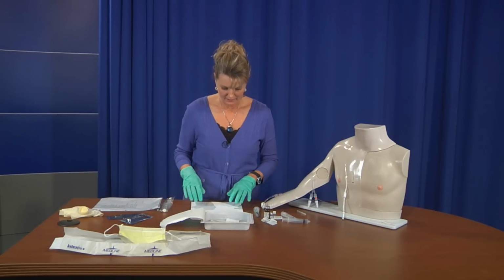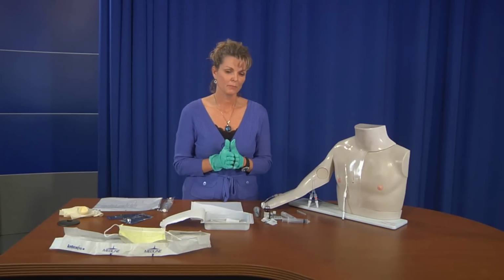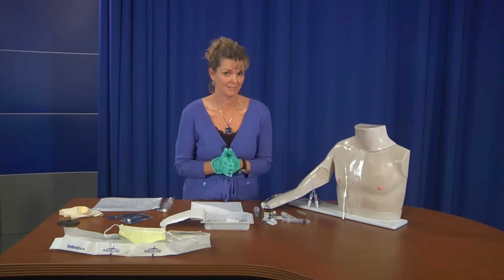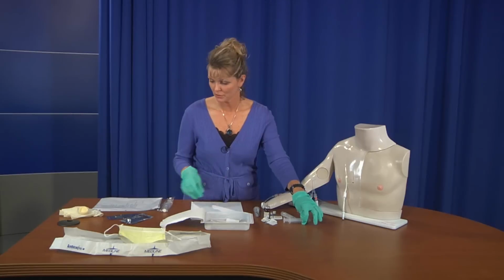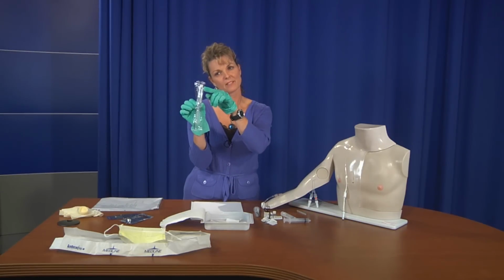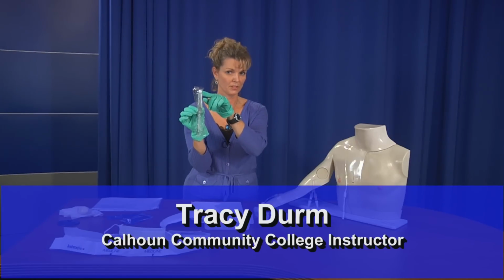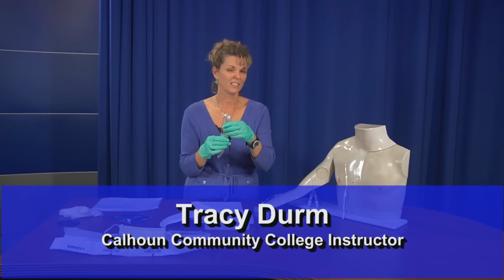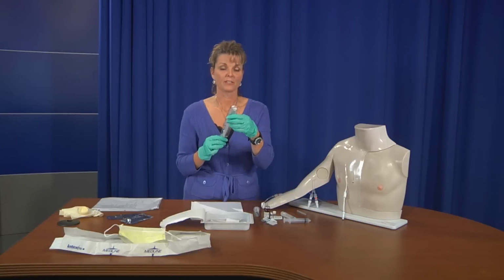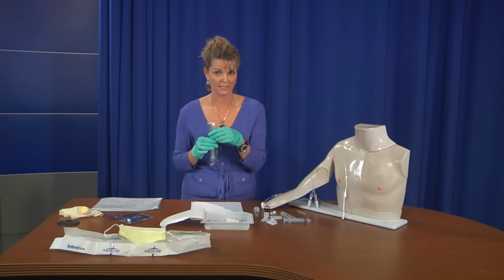The other thing that you want to remember, and maybe you want to verbalize, is that we need to make sure that we don't put any air in this line. So when you're using these flushes and they come like this, remember there's a little air bubble at the top. We want to clear it out first. Clear the air bubble first, because the instructor will get you for that one if you don't let her know that we're trying not to instill air into the line, because then it becomes an air embolism.